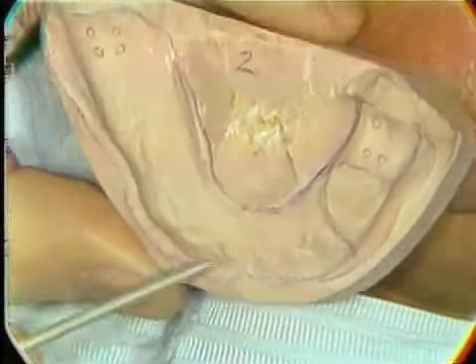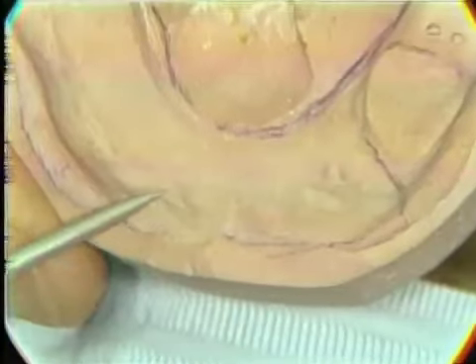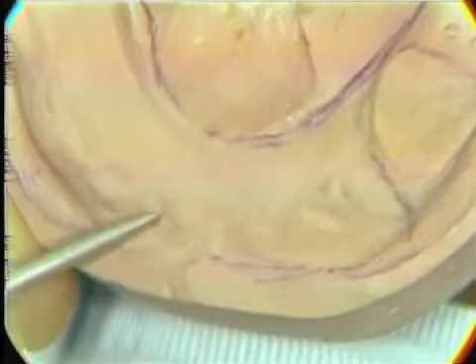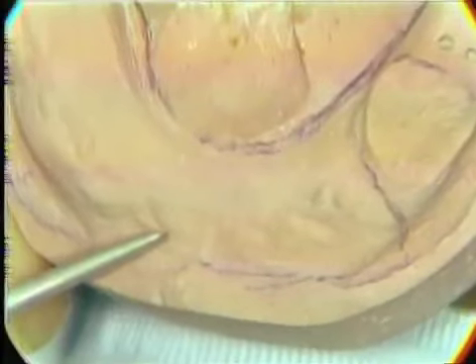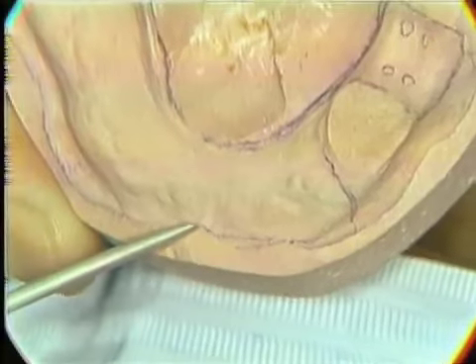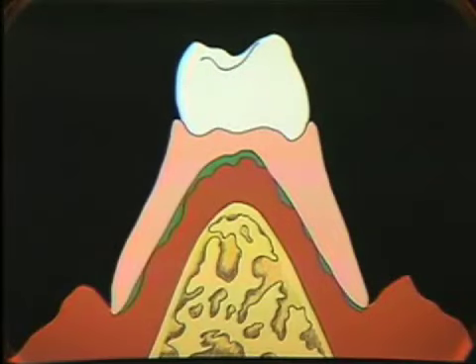And as you can see here, these little wrinkles, irregularities in the ridge tissue that we recorded, and we want to make a base that would fit these irregularities. Frequently, we use an impression material that does not record these details, and we wind up with a base that is void of these details. If we look at a graphic representation of this, we would find that the base at rest would fit on top of these irregularities and would not be an accurate fit of the ridge area. So the consequence of this would be when we use this base under function.